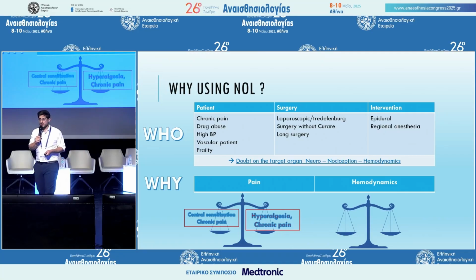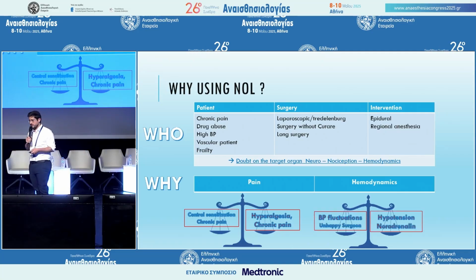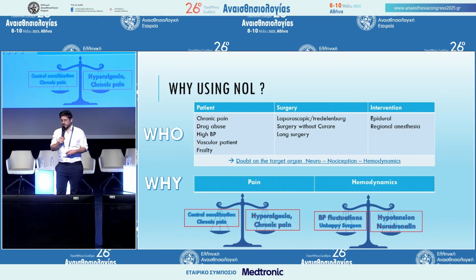Second answer, hemodynamic. I need the same equilibrium. If I'm giving much more than necessary, I will get hemodynamic instability, hypotension, and I will use vasopressors if needed.